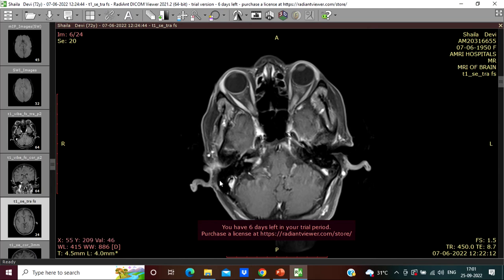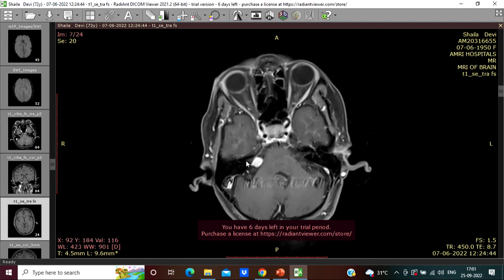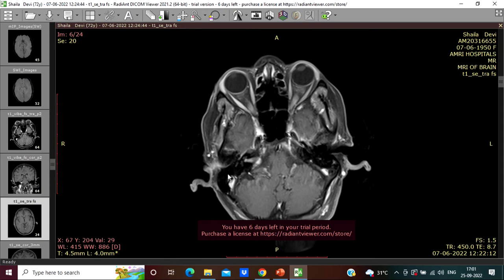We have adequate access from the mastoid. The patient doesn't already have, I would say, serviceable hearing. And if you try to preserve this kind of hearing at the expense of leaving the tumor behind, it is never a good option. So this is the ideal case for a translabyrinthine approach for any reason you ask me.